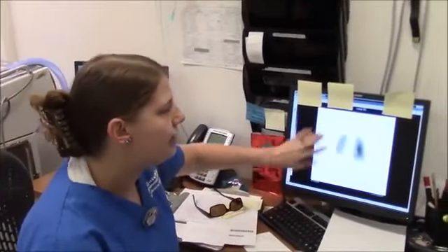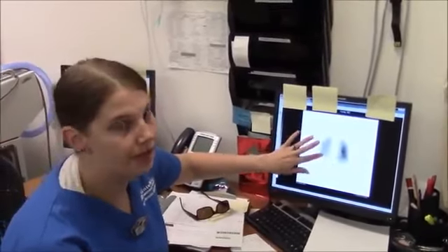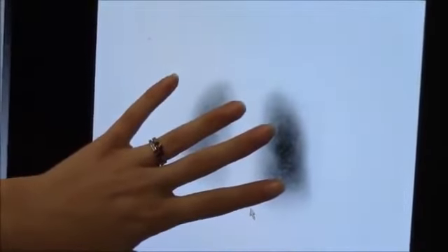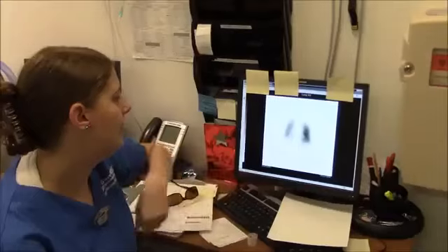Okay, so this is a raw image. This is our anterior view. So when you're putting the patient in to position them, this is what you might see on the P-scope. So it's easy to tell that you have all of the top of the lungs in, and to make sure that you're not missing any of the bottom. You can also see on the sides are both in there. Now we'll have an image like this for each view we took. We had 4 positions, but we were taking 2 pictures each. So we really have 8 images that look like this.